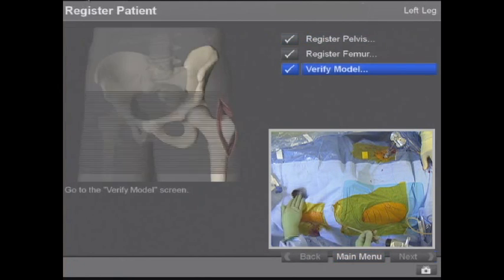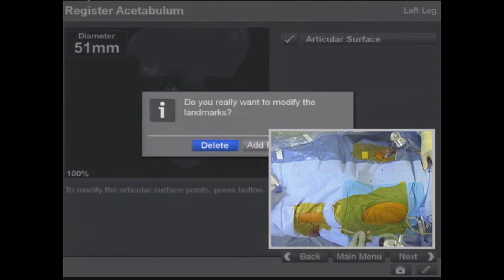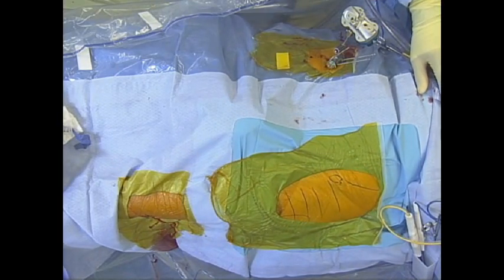We go back and delete the socket registration, since we're going to register again after we do our neck osteotomy. Now we're ready to start the operation.